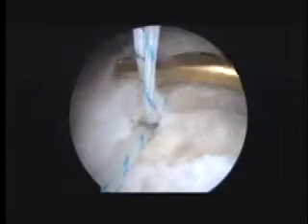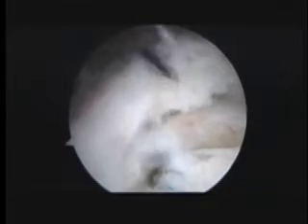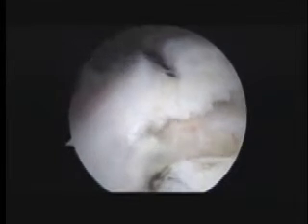So we'll reach in here and get the white one first. And then what you'll see here, on the left side of the screen, you'll see a suture hook. Here it is coming through. It's loaded with a black wire that we call a super shuttle. I'll show you that right there. Now we're going to reach in underneath here. Let's get this out of the way first. So we're going to reach in here and get this deep layer.